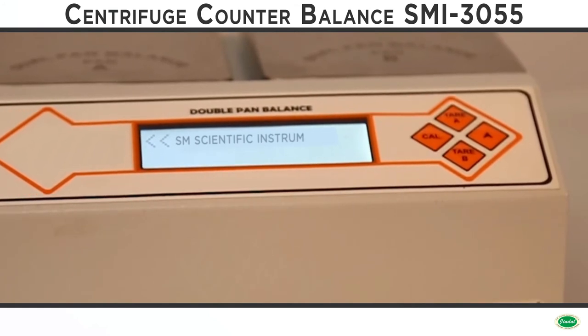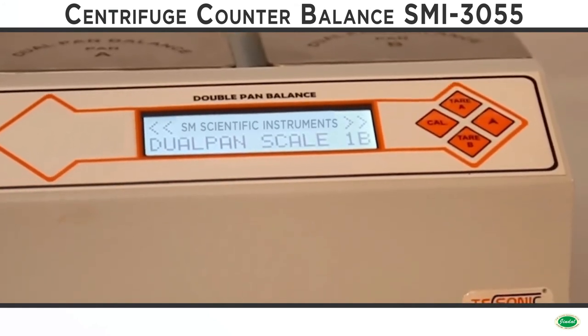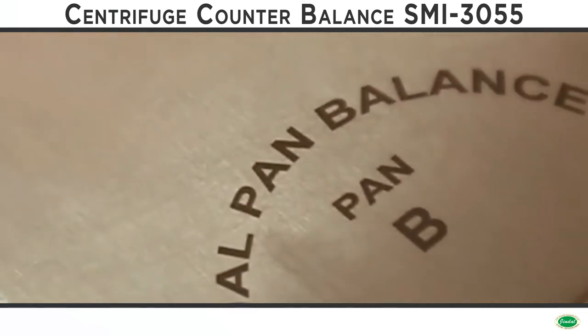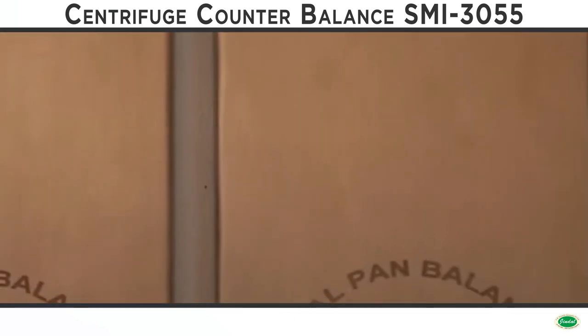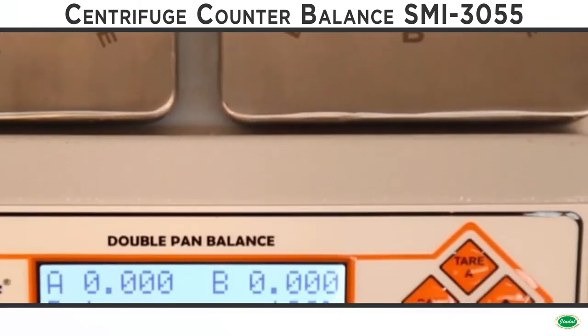Before loading the blood bag, the weights of the two loads — each blood bag plus bucket — have to be balanced in such a way that their weights should be the same or very close to each other.